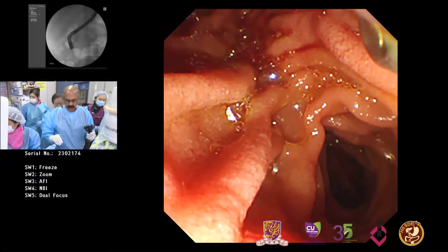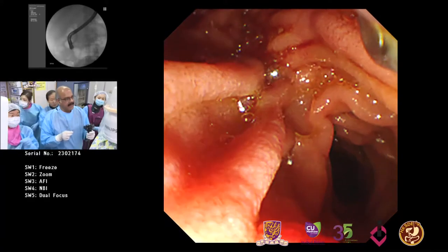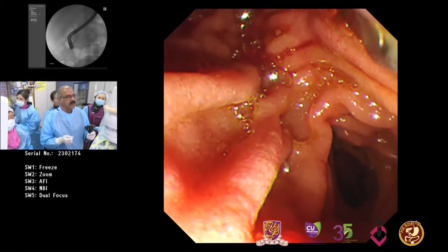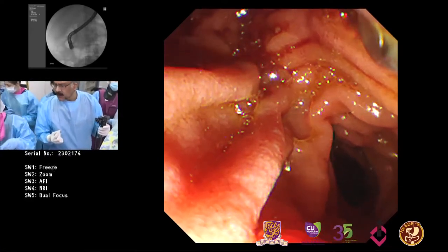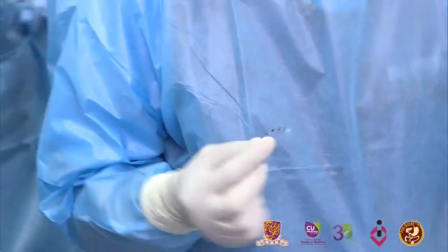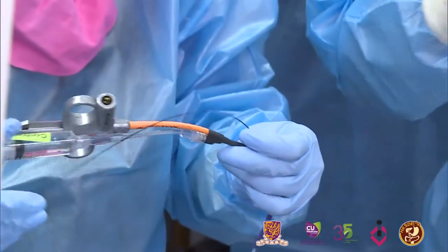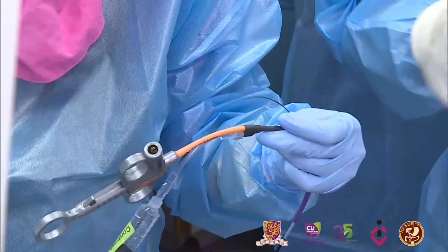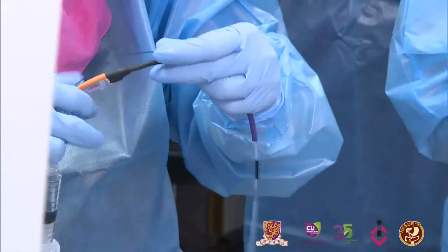So the first thing in this procedure we're going to do is a selective cannulation of the bile duct, and we remove the plastic stent. Hopefully that should be easy. For this I'm choosing a cotton cannulotome from Cook Company along with an Acrobat wire. The Acrobat wire I like particularly because it's very easy to manipulate. This wire is something like a Terumo wire, but I think it's a little stiffer, so you can do all your procedures on that.